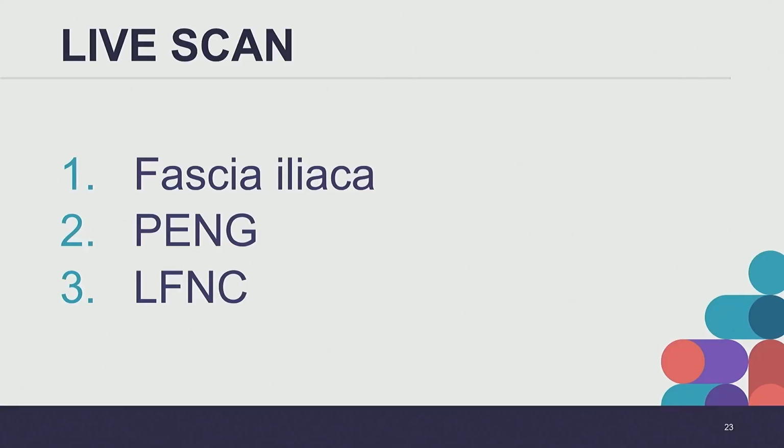I'm basically in the same spot where I would be for a femoral block or a femoral arterial line or femoral central line. And then I just come a little bit lateral and then fan. You can see how I can see all of the bone down to the target location with the iliopubic eminence. And then if I scan too far down, that's when I start getting into the leg and I get the head of the femur.